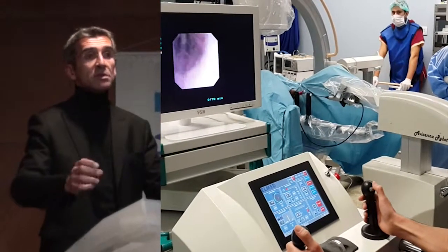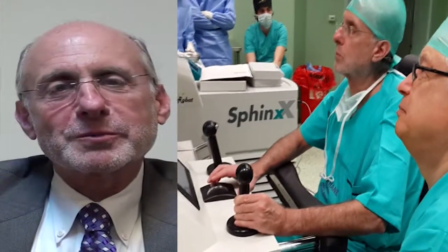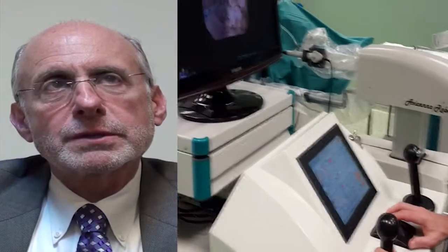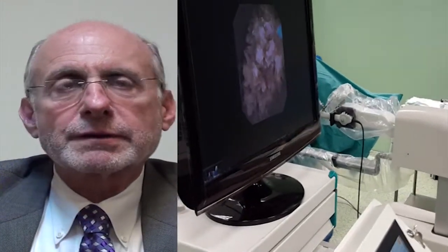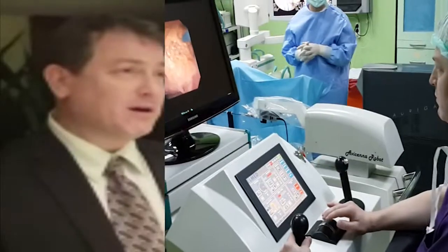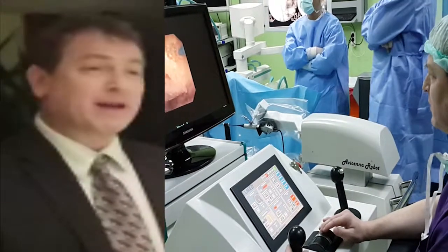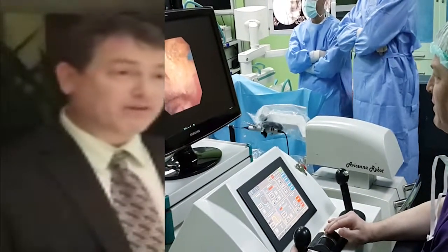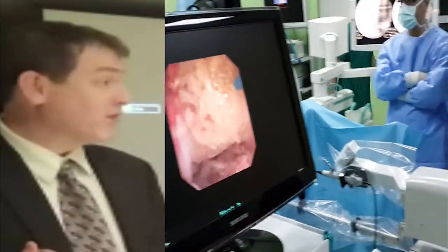To place the scope into the robot takes maybe less than two minutes. I was very impressed with the robot. It took a little bit of getting used to, but I think after three or four cases, you would feel very comfortable. The main advantages are going to be economic, from the perspective of less damage to the ureteroscopes. Secondly, it is an advantage for us to be further out of the radiation range.